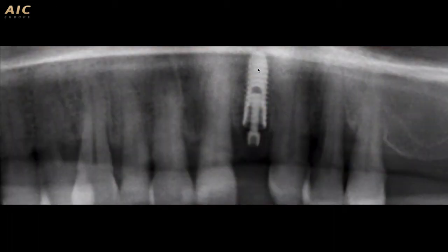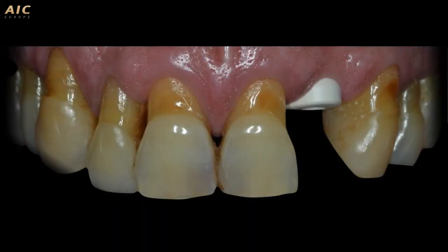This is the X-ray at the end of the treatment. I'd like to underline that in this zone the best implant is the mini platform, 3.5. But because of the type of the extracted tooth, I chose a regular Osstem TS3 implant.